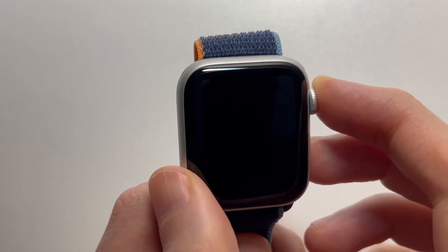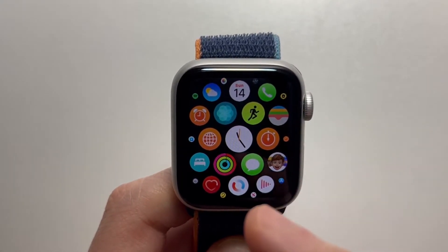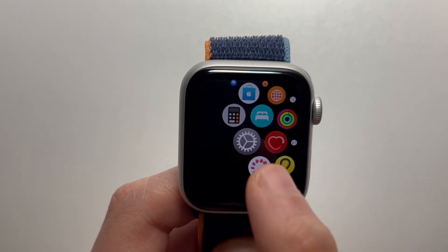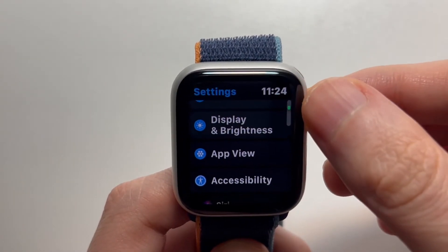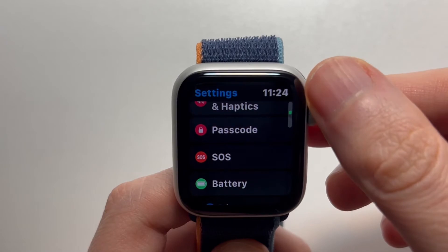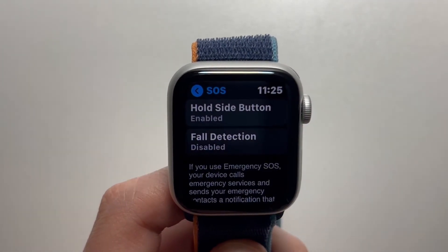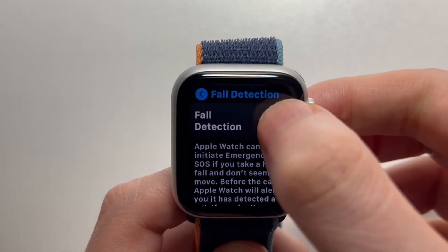Alright, so all you do for this is press on the crown to go to your apps, and then you're going to press on your settings. Now you're going to scroll down some and press on SOS. Now you can see fall detection, so press on that. And just enable it.